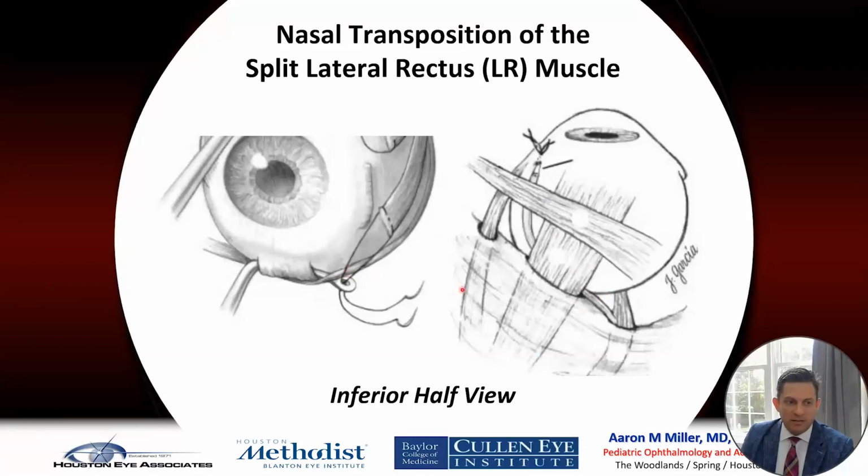You've got to get under that white triangle. For those that do inferior oblique surgery, it's that white triangle on the inferior oblique. When you're looking back, you want to hook through that around it. That's how you're going to get behind it, going in through that triangle to be able to pass the sutures through that pathway, and again, pulling that over more nasal.